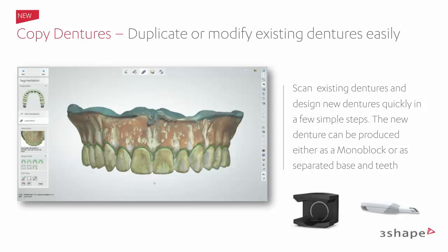Then there's a question from Mark Wilson. When designing with digital impressions, why can the scan not be watertight? I believe it's to be able to do block out. There are some algorithmic reasons why it cannot be watertight. Yes, it is a technical issue that prevents it from being watertight. But this is also something we know is a question we've been asked before, and we are investigating how we can do that better. But thanks for bringing up the question.